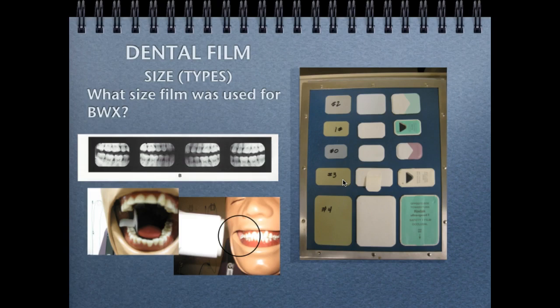You might wonder why it's not used more often, because it certainly would reduce the exposure to the patient. Sometimes it's difficult to get a diagnostic quality, like open contacts. I mean, it can be done. You know, we are striving to be the experts here in obtaining radiographic images, so it just takes some practice.